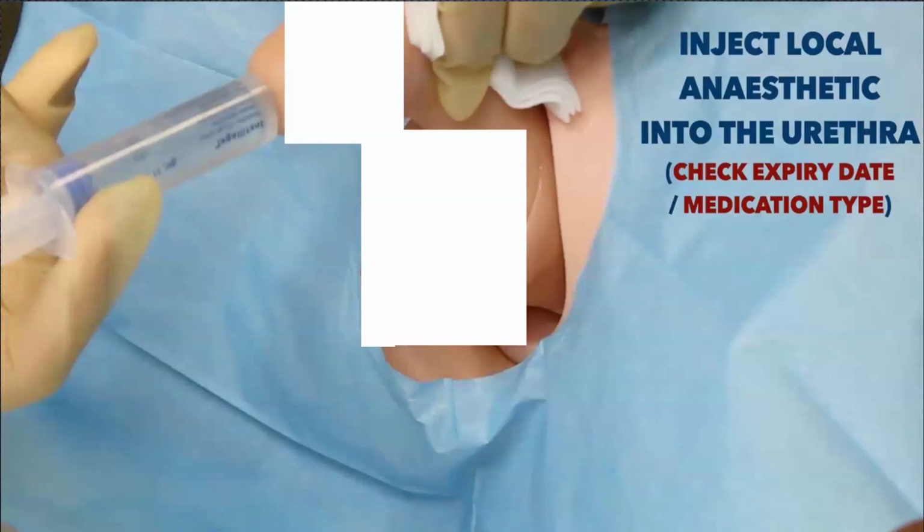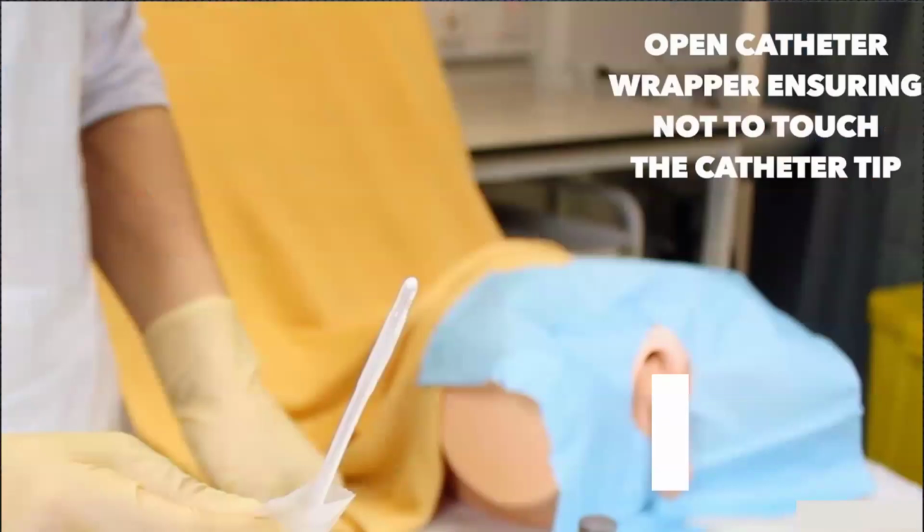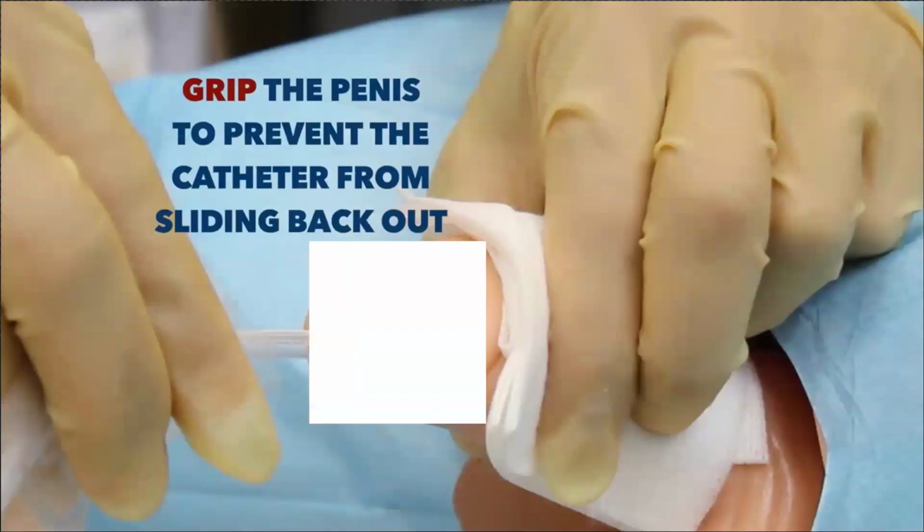So you just open the tip of the catheter, and then you go ahead to advance it this time around. You just put it in, trying to make sure not to touch the catheter at all. You usually have a plastic wrapping around it, so just hold on to that. Then as you pass it, check with the patient to make sure the patient is not in pain or any distress.